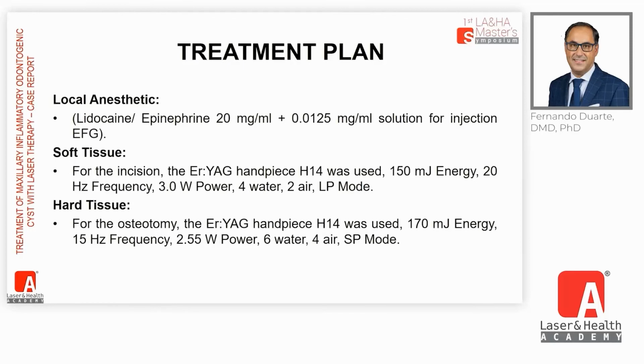Our treatment plan was local anesthetic, a combination between lidocaine and epinephrine, and using the laser.